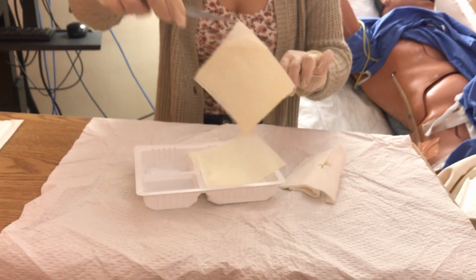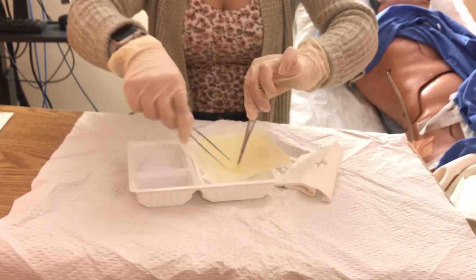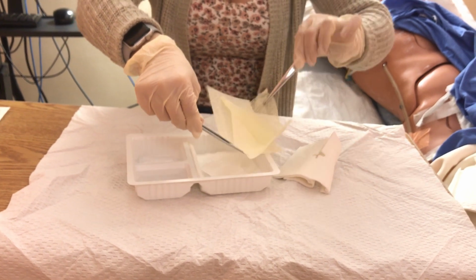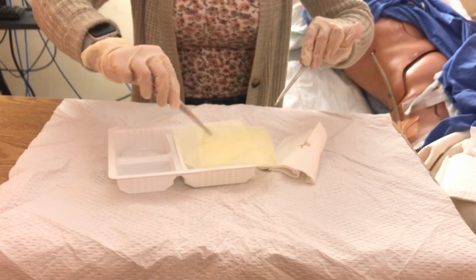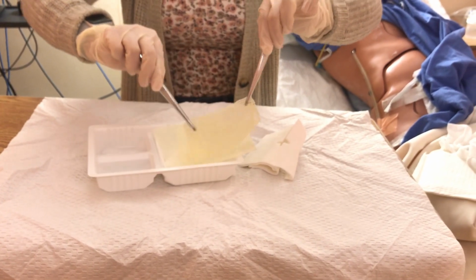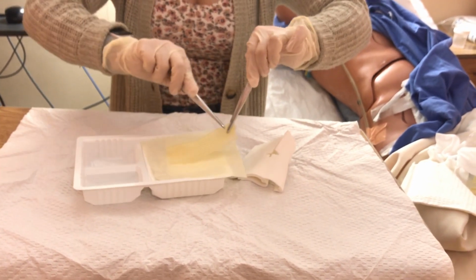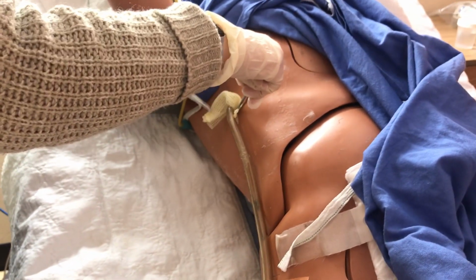So right drug, right patient, right composition for this patient. And he has consented to this procedure. He understands that because he's not taking anything in. So I'm just going to fold it over a few times so that it can fit nicely around the stoma. So my second nurse would come in, she'd check everything I did, the rate, the total, and then we can press start.